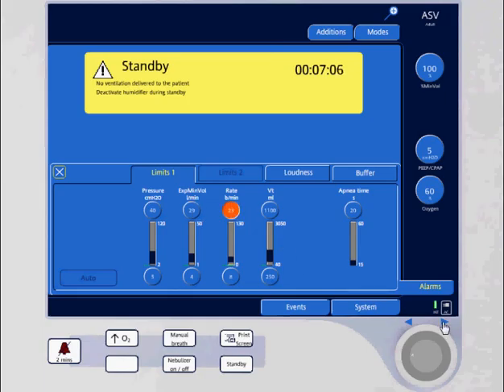So if you have the pressure setting at 40, it's going to only allow the inspiratory pressure to get up to 30.